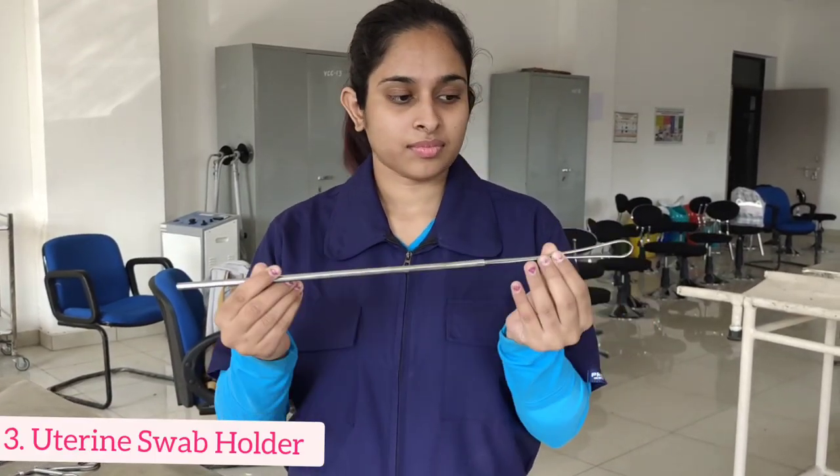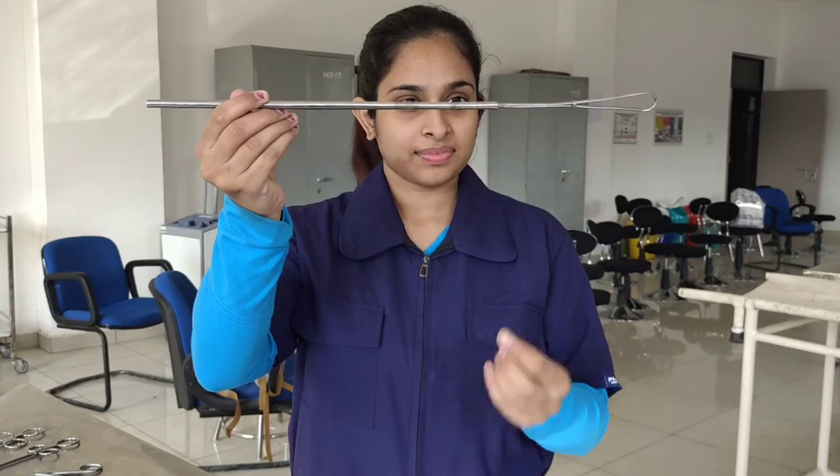Next we have this uterine swab holder and it's used to hold the uterine swabs in place. It opens and closes like so and it's pretty easy to use.